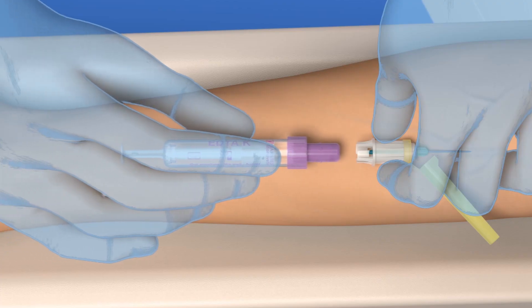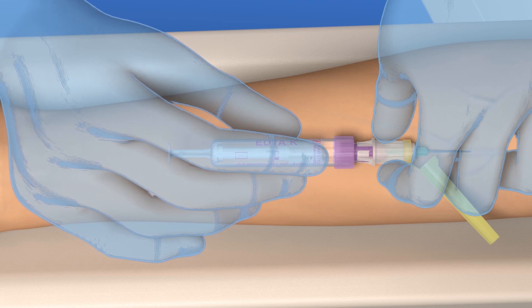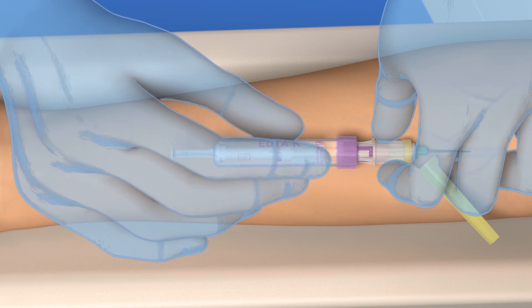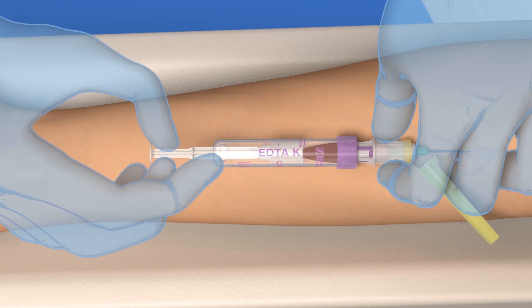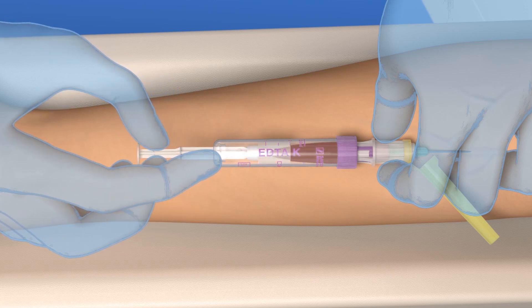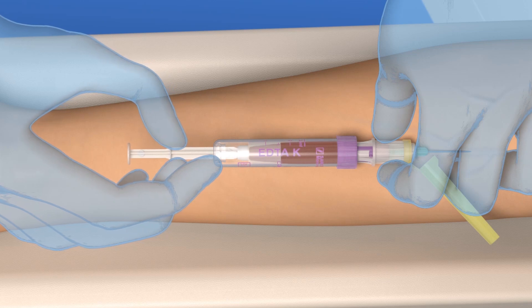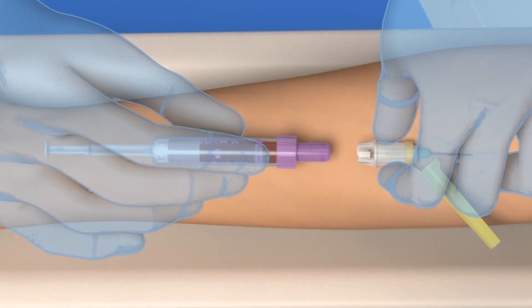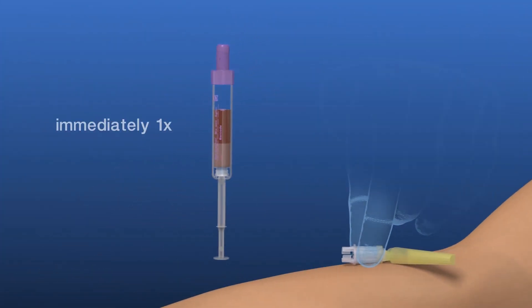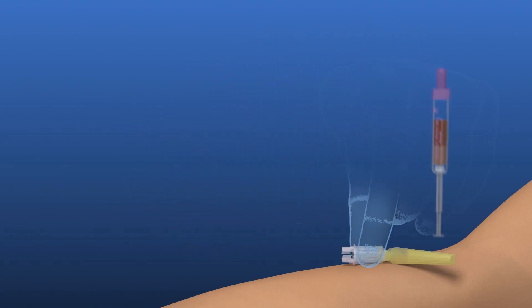Connect the next S-Monovette to the safety needle. Repeat all the previous steps as for the first S-Monovette: gently pull the plunger until it will go no further and wait until the blood flow stops. Remove the S-Monovette from the safety needle. Invert the filled S-Monovette once and store it in an upright position.